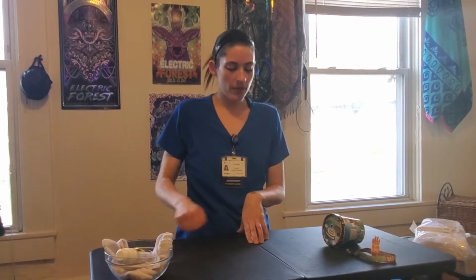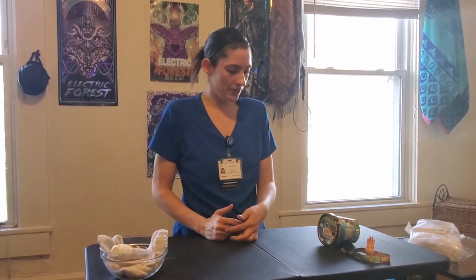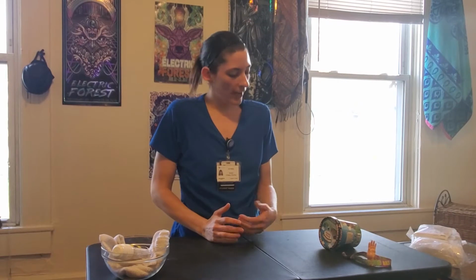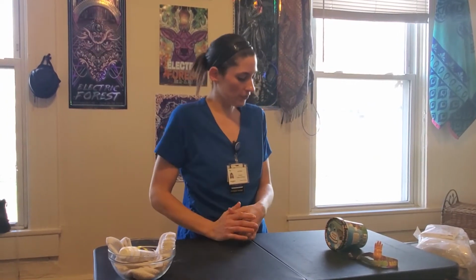So now I'm going to go to the patient's room, wait to be invited in. Hello, Ms. Harumi. How are you doing today? My name is Kat White. I'll be your student nurse this afternoon. I'm going to do your Foley catheter, if that sounds okay with you. Patient confirms her consent. I'm going to provide for privacy and perform hand hygiene again.